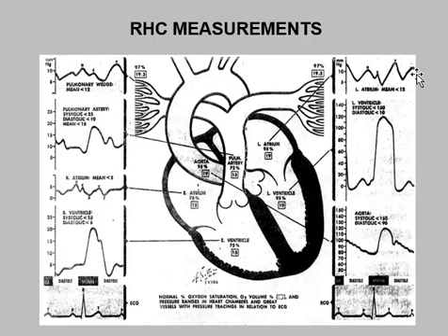Well, it's not actually flowing, but the pressure is being transmitted along that continuous, unbroken line, there are no valves in between, to that distal point of the pulmonary artery. That's as much as I'll say right now, or this lecture will become very long. But go through that, and if you read the books, you'll understand it possibly a little bit more clearly.